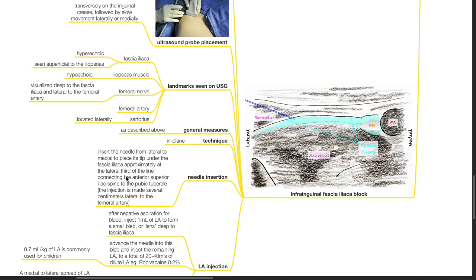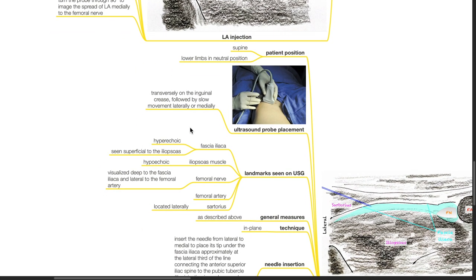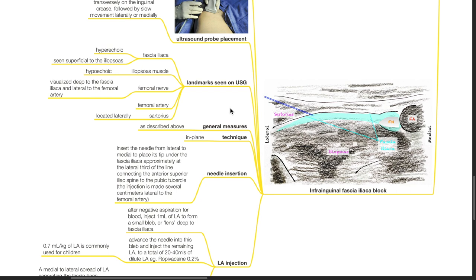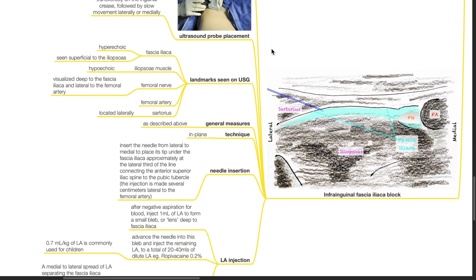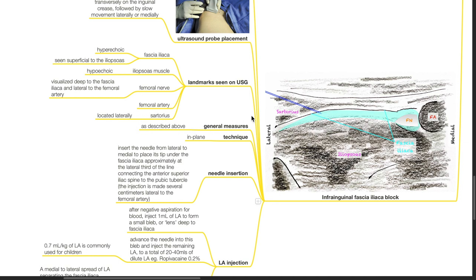Infrainguinal fascia iliaca block. Patient should be positioned supine with lower limbs in neutral position. The ultrasound probe should be placed transversely on the inguinal crease, followed by slow movement laterally or medially. Landmarks seen on the ultrasound include the fascia iliaca, which is hyperechoic and seen superficial to the iliopsoas; the iliopsoas muscle, which is hypoechoic; the femoral nerve, visualized deep to the fascia iliaca and lateral to the femoral artery; and the sartorius located laterally. General measures as described above; in-plane technique is recommended.